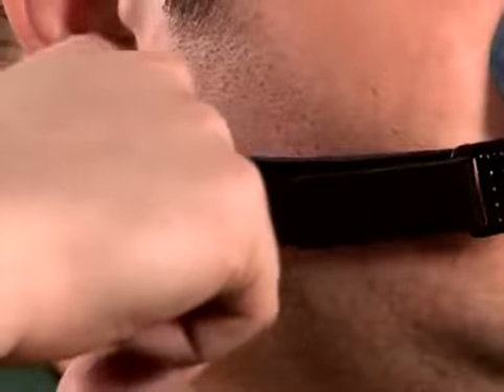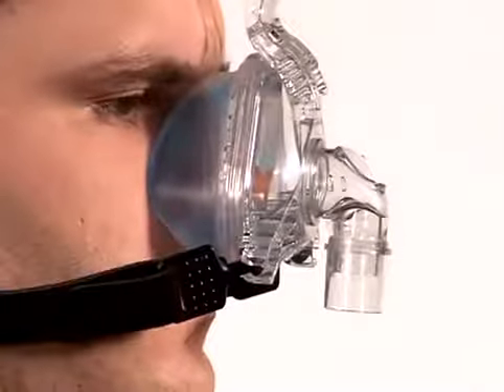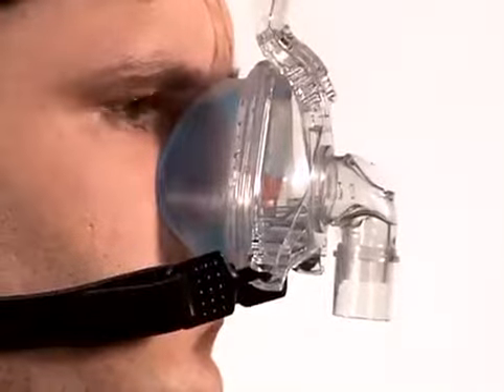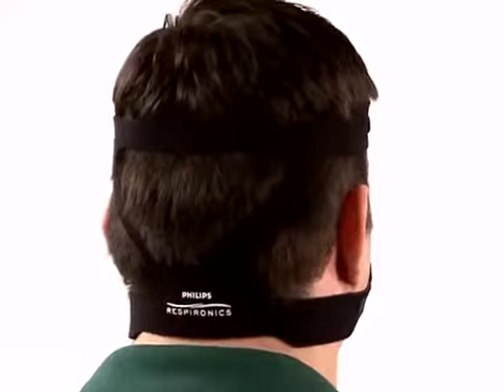Adjust the bottom headgear straps by using the Velcro tabs. Be sure that they are tightened evenly and the mask is gently sitting on the face. Do not over-tighten the headgear. Check the headgear to make sure that the straps are parallel and that the headgear is fully extended and flat across the back of the head.